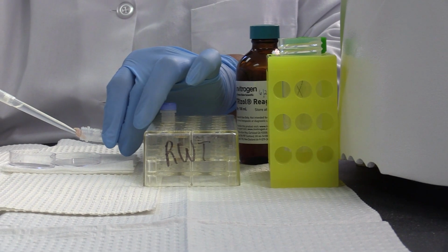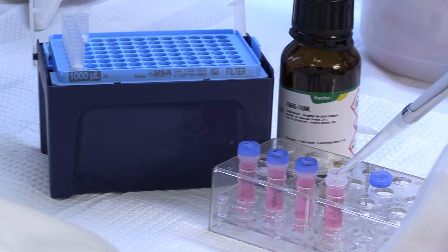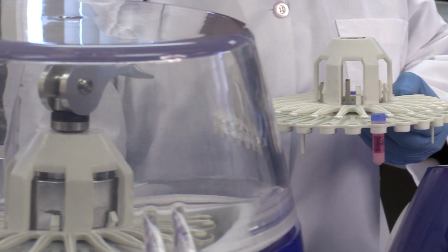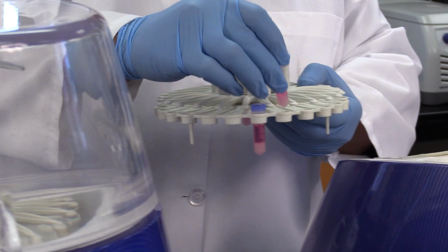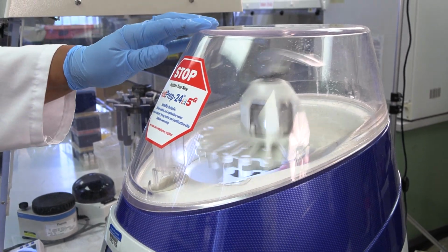Researchers at NHDP have also developed an RNA-based assay to determine the viability of M. leprae in patient samples. Viability testing can be used to monitor treatment efficacy in multibacillary patients and can also be useful in suspected relapse cases.